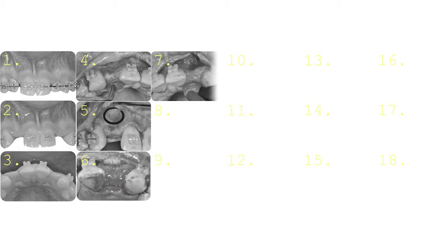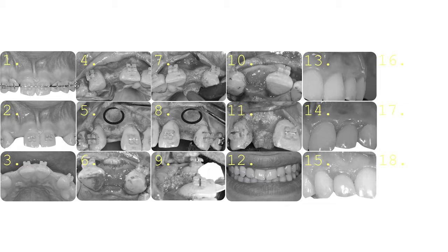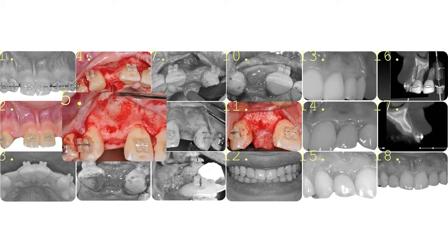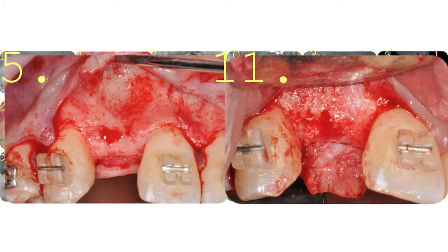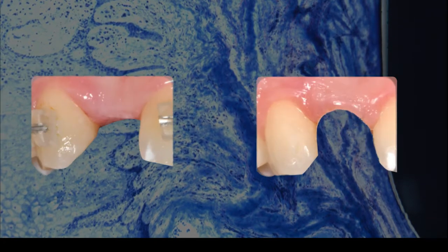And here again, we're dealing with a very simple, straightforward case because the neighboring dentition doesn't have any kind of periodontal attachment loss, which means that when I'm going to sculpt my soft tissue and try to give the illusion of the natural scalloping, I can apply a lot of pressure without having recession on the neighboring papilla. That's before and after. And that's how we start sculpting everything.